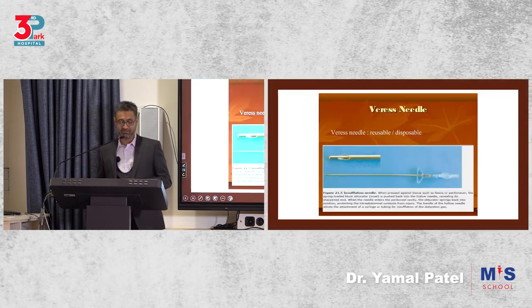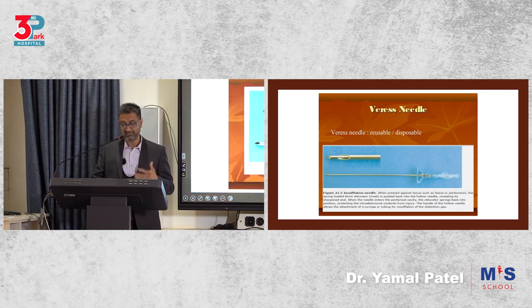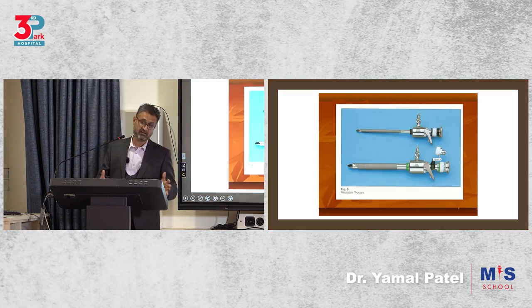So you must have discussed the Veress needle. I'm not going into this. Remember, this is an overview. So what is the Veress needle used for and how does it work? What are our trocars? I mean the ports.